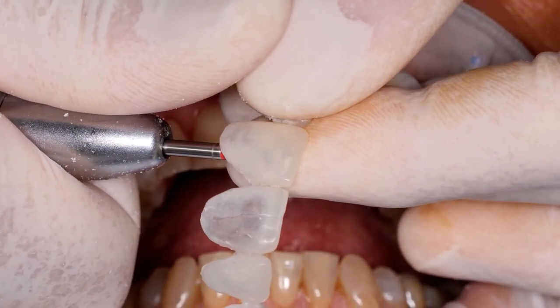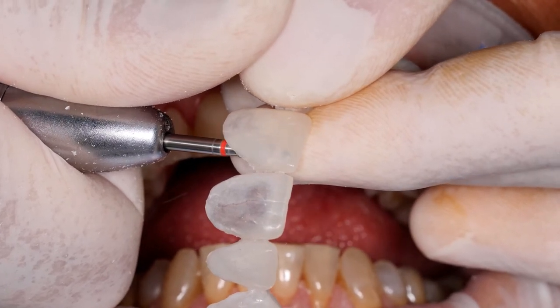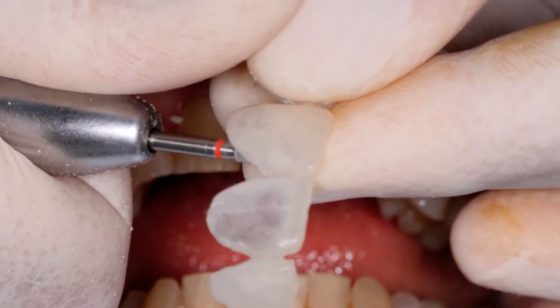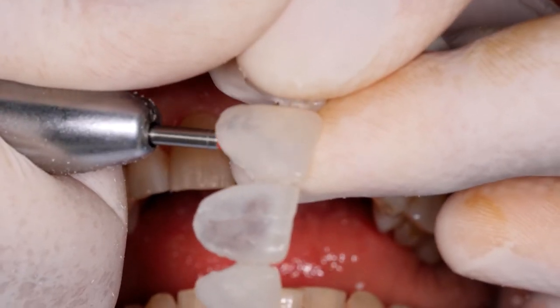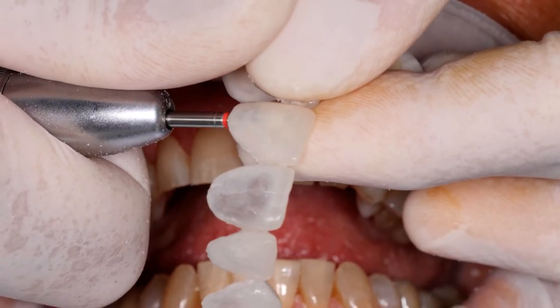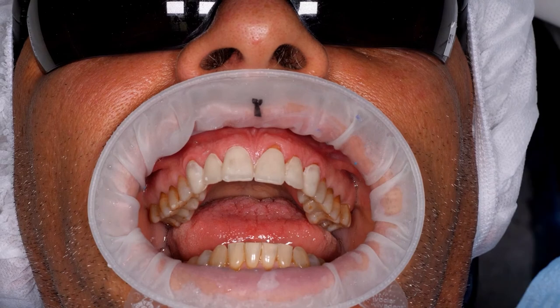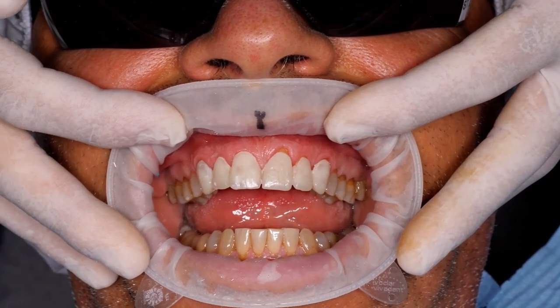You can see the burr through the shell, can't you? So we are slowly advancing towards the buckle. This is the kind of work that dental technicians must do on the shell. At a certain point, however, the shell gets very thin, so even when you hold it in your hands you run the risk of breaking it. We can snap it on and it fits tightly. We will still have to trim it a bit later, but we have seen that the undercuts are not a problem.